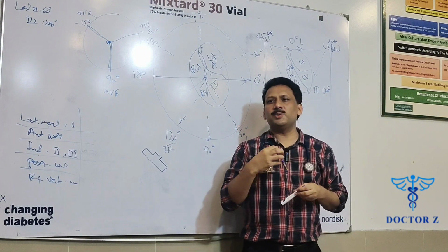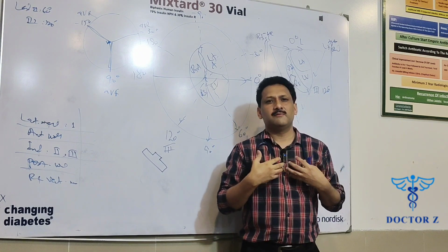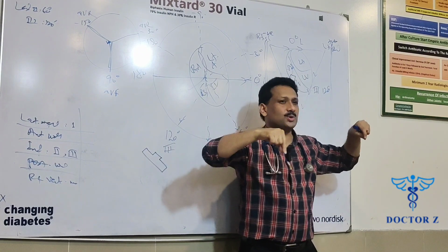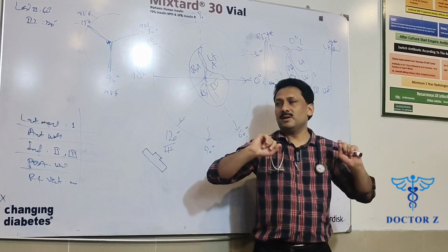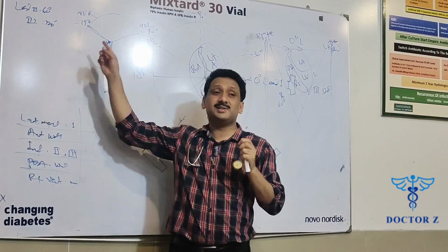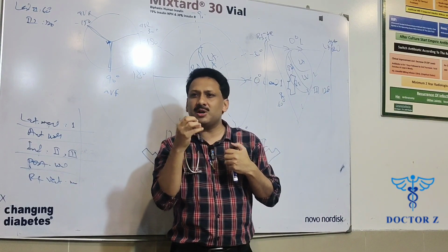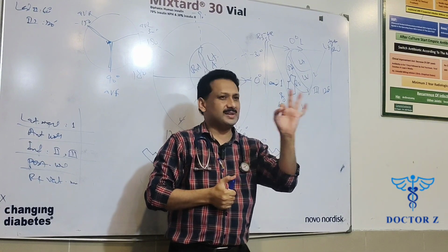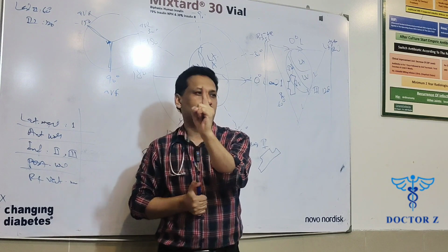I earlier told you that current is being dissipated in all directions from the heart, and these electrodes which we have placed over the human body are basically reading that current. Now we are studying, through these unipolar augmented limb leads, the dissipation of the current from the center of the heart. So we take the center of the heart as one unified pole.